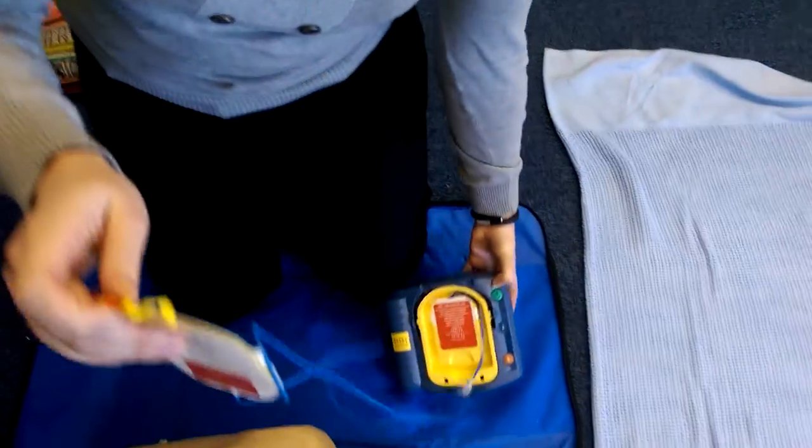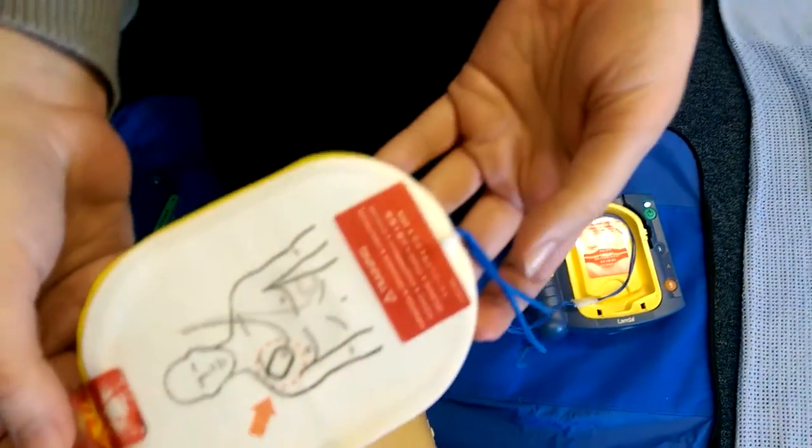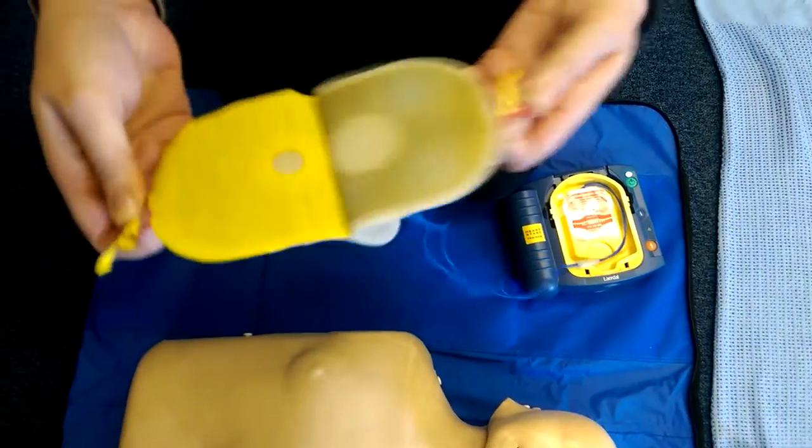Next we take the pads out. It shows pictures on the white adhesive pads. 'Peel one pad from the yellow plastic liner.' It shows us where both pads need to go, and we do them one at a time.